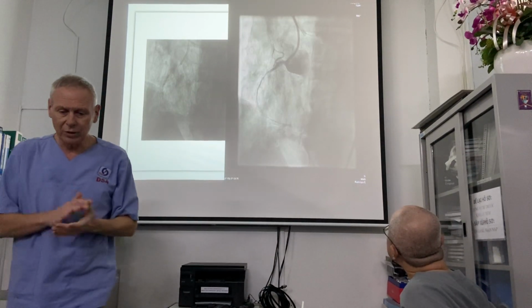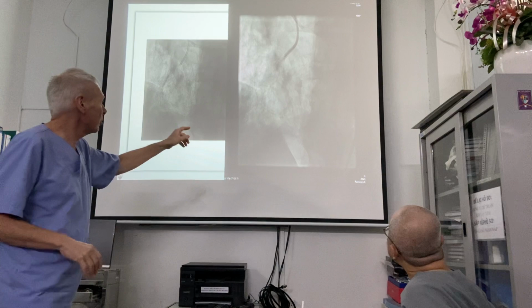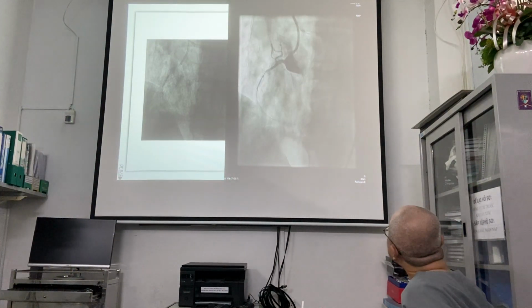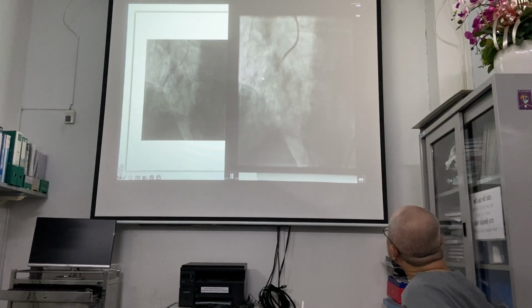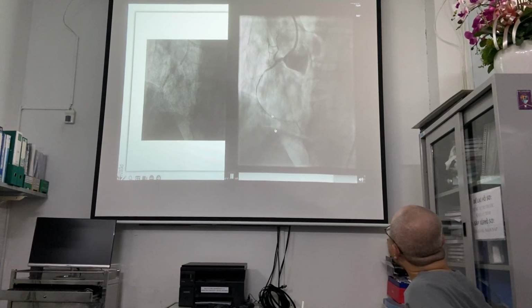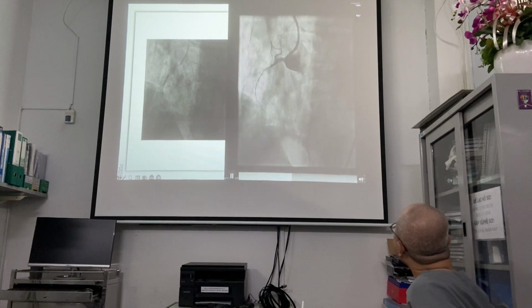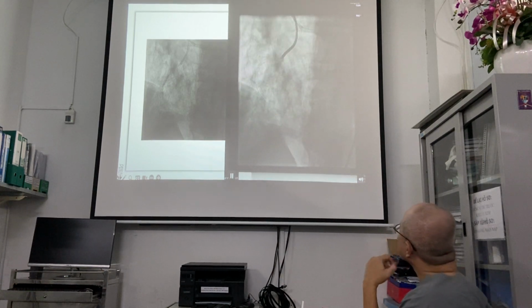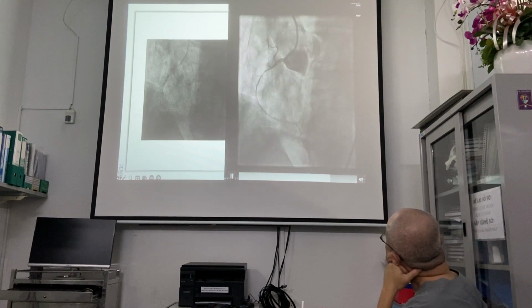So it is impossible to dilate because the CTO is here, here, and here, but at the mouth of the CTO is this undilatable lesion. This lesion is very calcified. Very calcified, yes. So the decision at that moment is to use a rotablator. But of course, you have to get the rotor wire through.